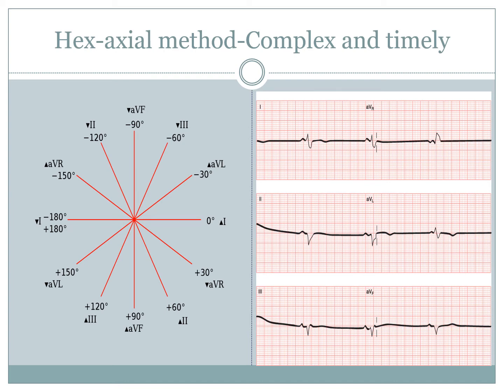Because we're dealing with amplitude and direction of travel, we've already mentioned that there's bipolar lead travel, so towards a positive and a negative end. Each one of those polarizations can be represented in a 360 degree fashion, where we have positive degrees versus negative degrees. Obviously the negative degrees sit at the end where most of the negative poles are. If you remember back to the triangle, and we'll look at it again, the top half of the circle was the negative side, the bottom half was the positive side.